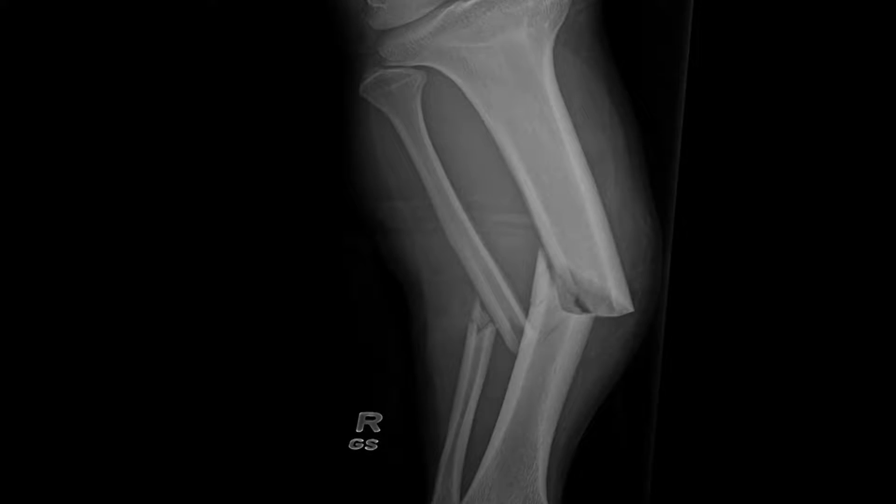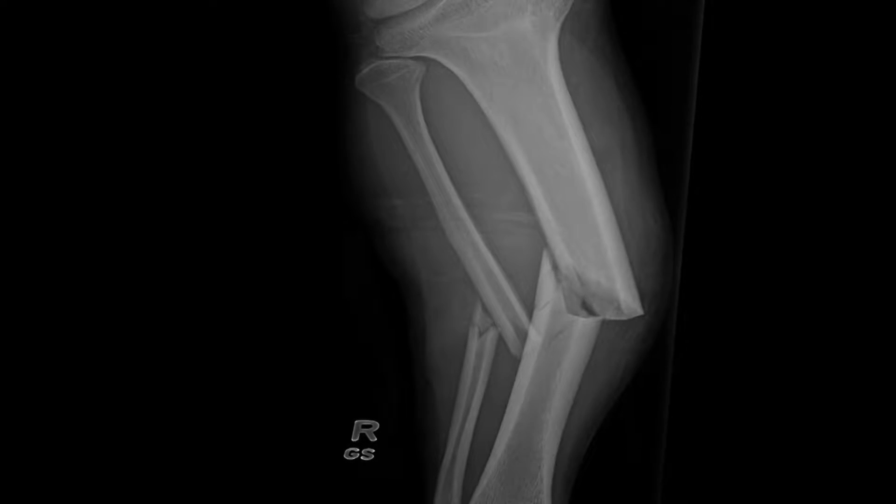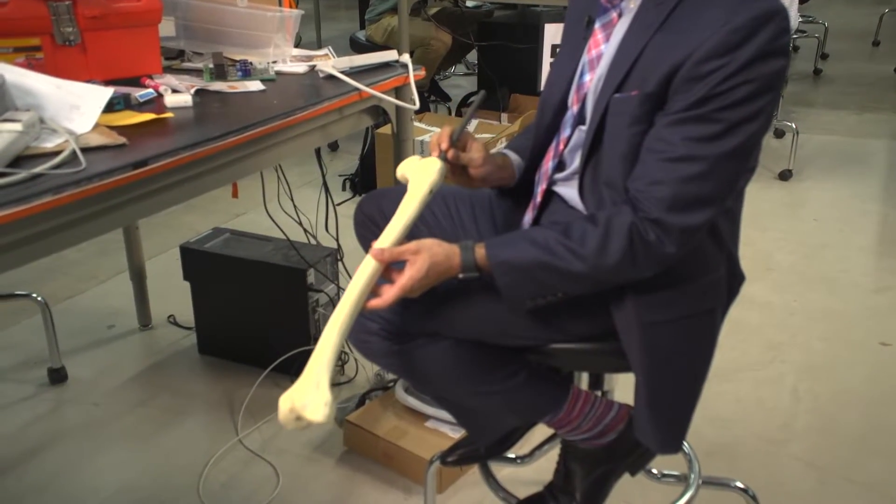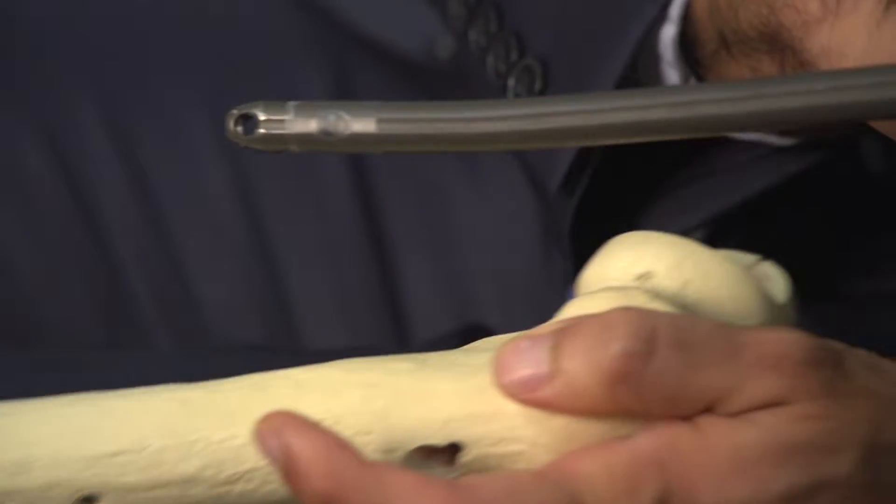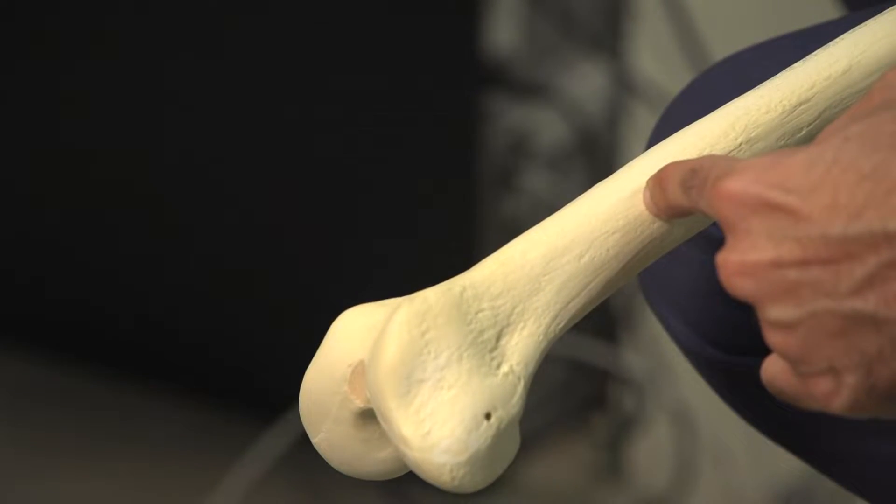The stress is building. But when it comes to a long bone surgery, time is not on his side. The surgery involves placing a rod in the patient's leg and securing the rod through a hole at the bottom. That means drilling blind through hard bone.